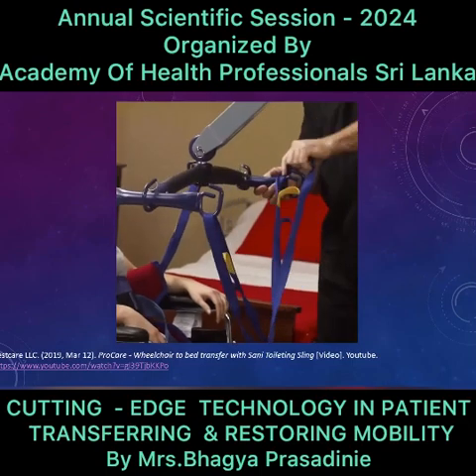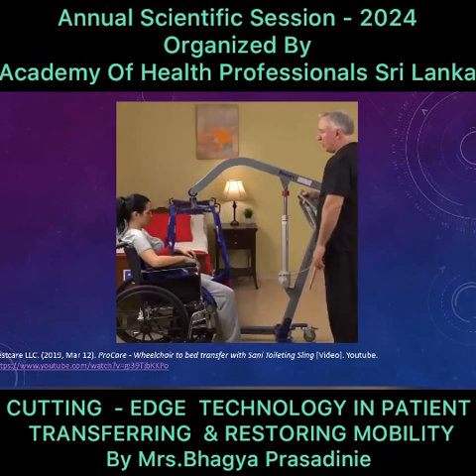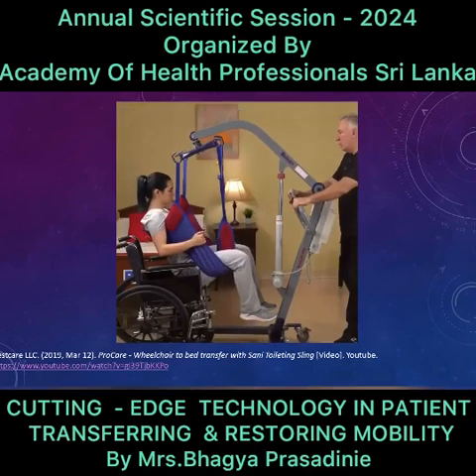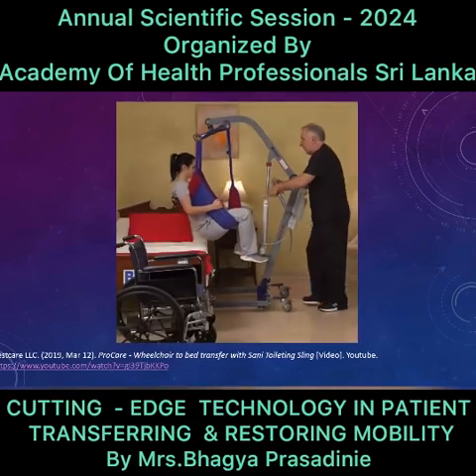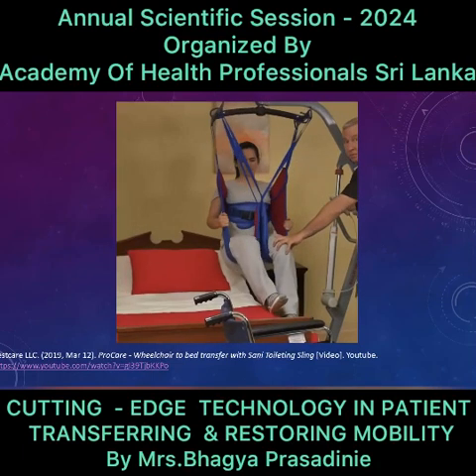In all these things, we need to introduce the movement technique to the client, to the patient. So you can see that this is particularly a toileting sling, because there are various types of slings that are used to take the patient up from the sitting position or lying position.